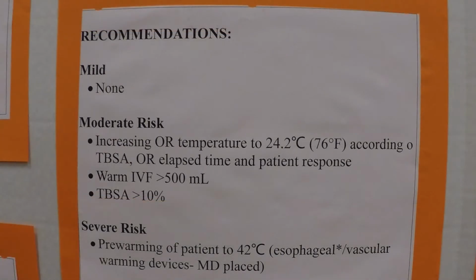Recommendations. We have mild, moderate, and severe risk. Mild is none. Moderate risk: increasing the OR temperature to 76 or 80 degrees, according to the TBSA, elapsed time and patient response. We warm our IV fluids for anything greater than 500 cc's as a standard, and then we have our Ranger warming device for all of our other fluids. Our TBSA will be 10% or more in the moderate risk category.